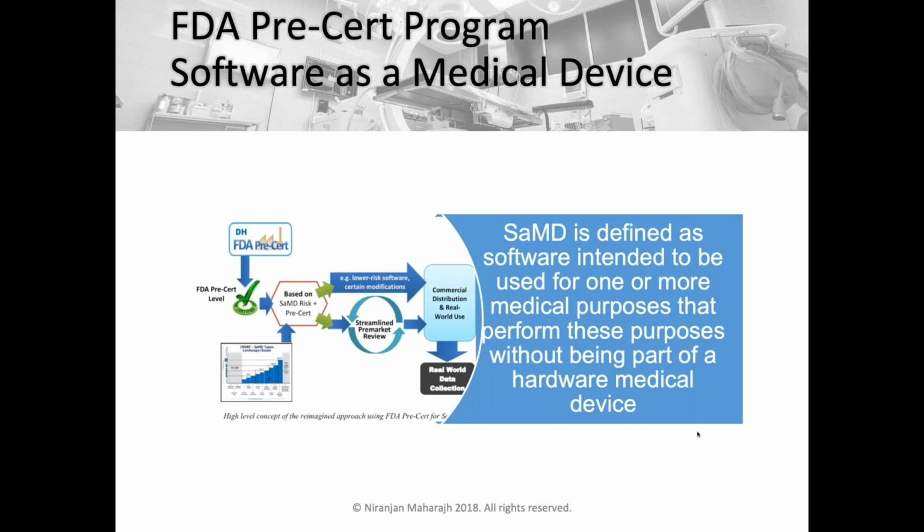If you're out here in the Silicon Valley area, or in the Boston area in the Northeast, you'll see this topic of software as a medical device becoming the next thing. And within this next thing, the FDA recognizes that its existing regulations are not sufficient. So it's creating new guidances around how this is going to work from not only a software development, but a software testing perspective. From the software testing perspective, what's really driving this is the idea of post-market monitoring.